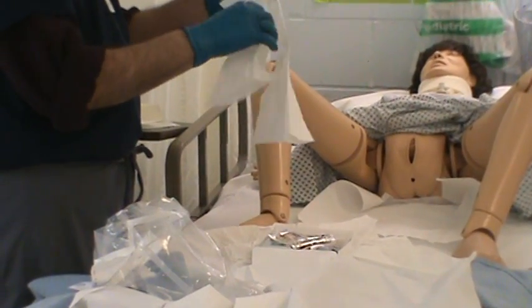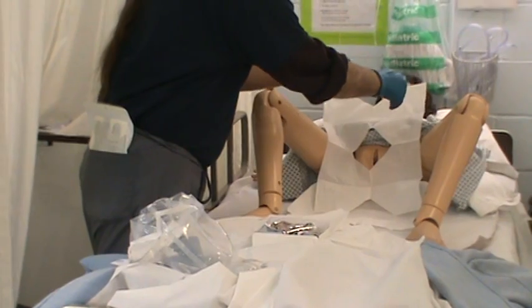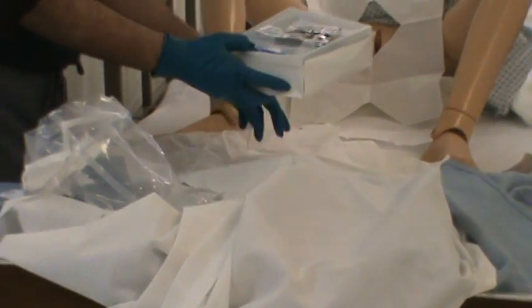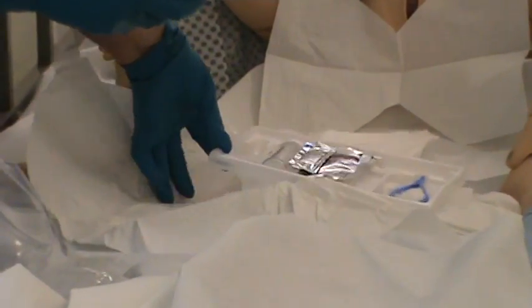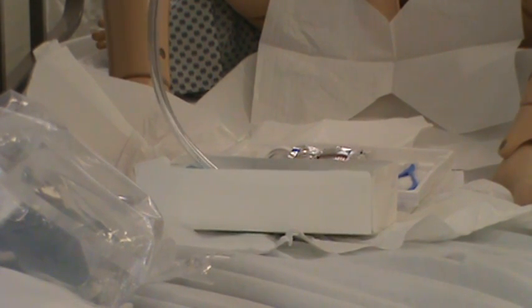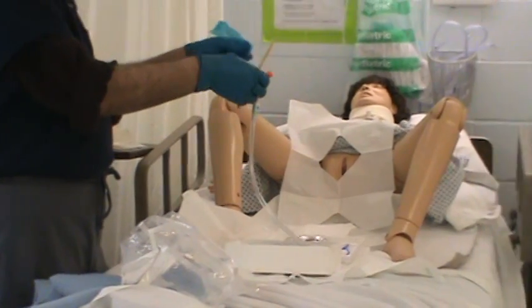This is a little drape that you could use — generally we don't, but I'll show it in use. I'm opening the kit and moving things around. This inner part is sterile — I'm touching a sterile field with my sterile glove. I was always taught that you have to check your balloon. Nowadays a lot of places are saying you don't have to check the balloon, but since I'm old school, I'm going to check my balloon.